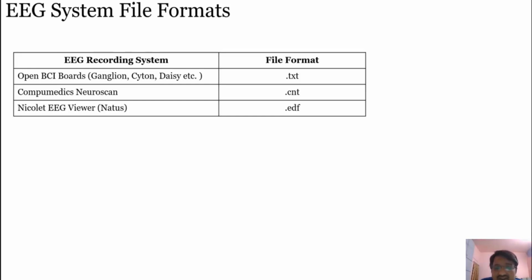So next would be these 3 demonstration videos of acquiring EEG and events from recorded files, and that will conclude this submodule, as well as this 4-part lecture series on brainwave recording, acquiring, and processing. We have only seen loading the brainwaves into MATLAB. Further, if time permits, we will see how you can process it.